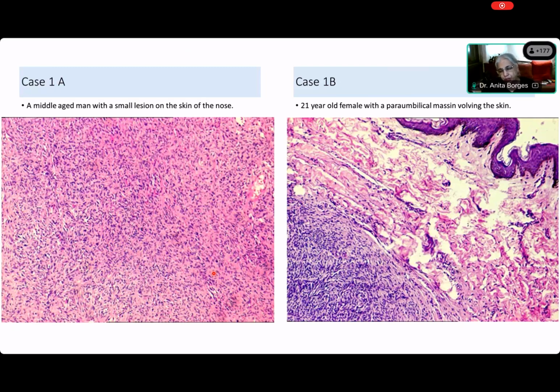Plexiform, so hemangiopericytomatous is plexiform. And we have sheets, right? Yes, so now all of these we have named. Saida, which one is this? Haphazard pattern. Haphazard, you really think it's haphazard?